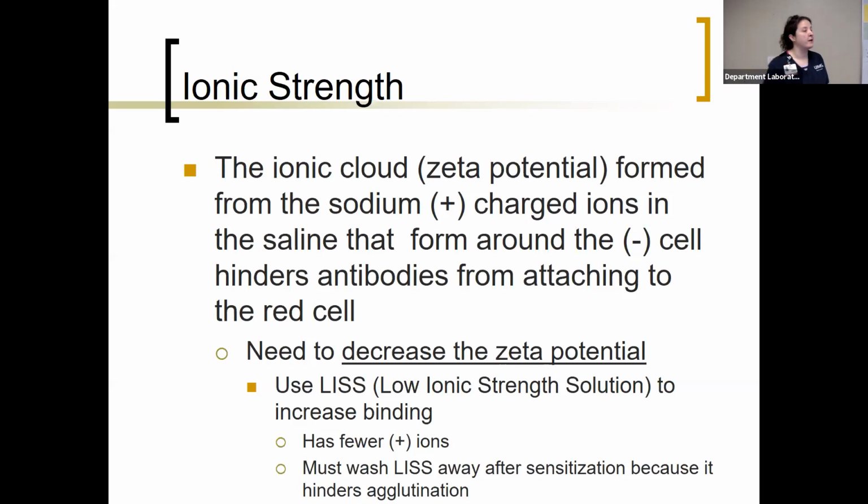You guys in the academic 9B lab will use LISS. Do not be surprised if once you enter the blood bank clinical labs, they do not use any enhancement media, whether it be LISS. There's another one we're going to talk about, PEG. Some people might even still use albumin. I doubt you'll ever see them using albumin. It's really kind of obsolete. Hardly anybody ever uses albumin.